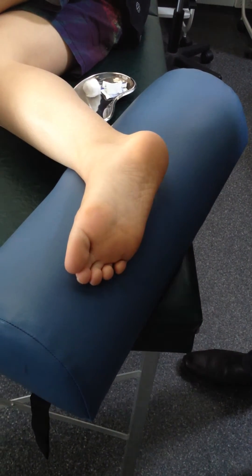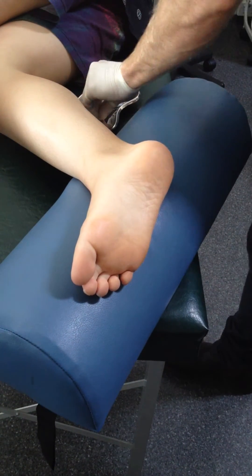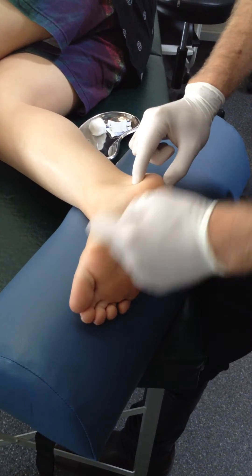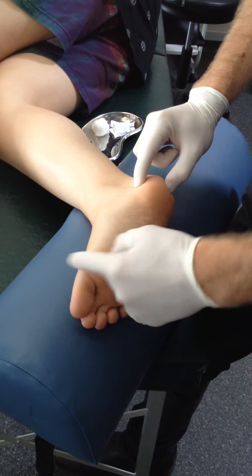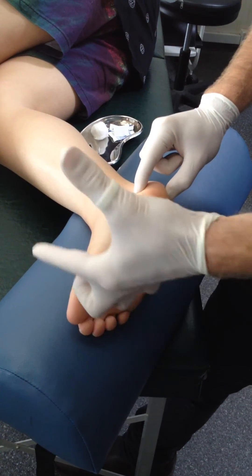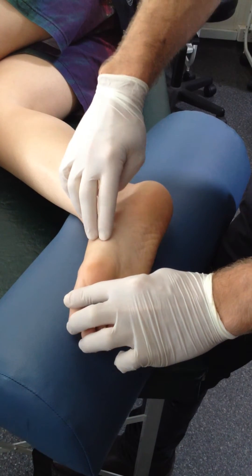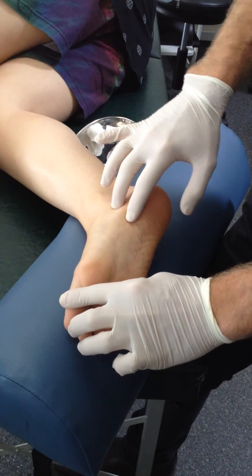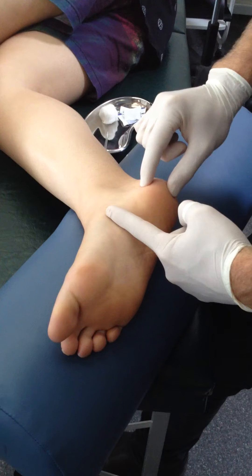We're going to needle the abductor hallucis of the right foot. The muscle comes off the medial surface of the calcaneus and runs down onto the base of the proximal phalanx, abducting the toes. If you push out against me, you can see that tendon popping up, and then the bulk of the muscle is back here.